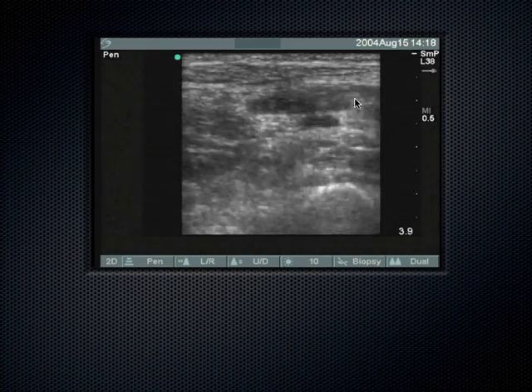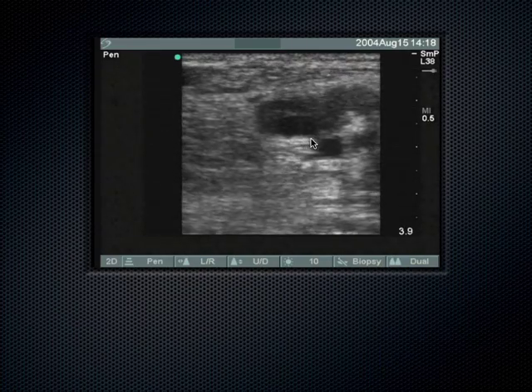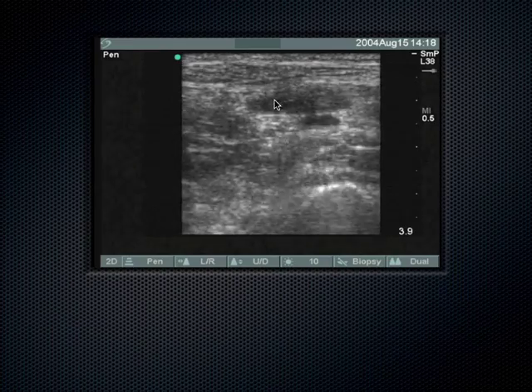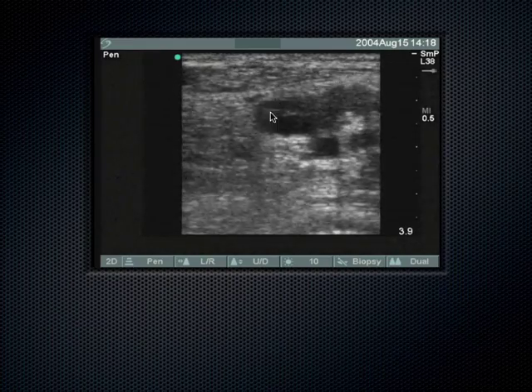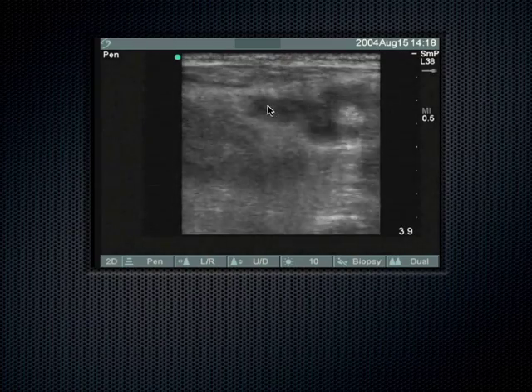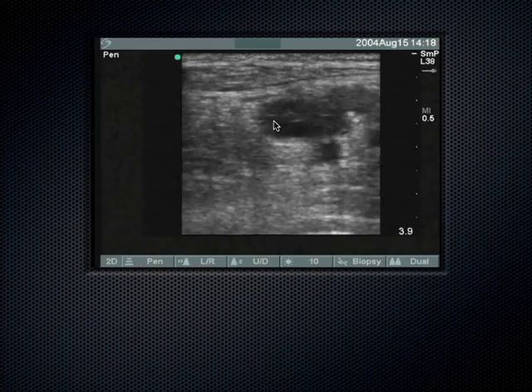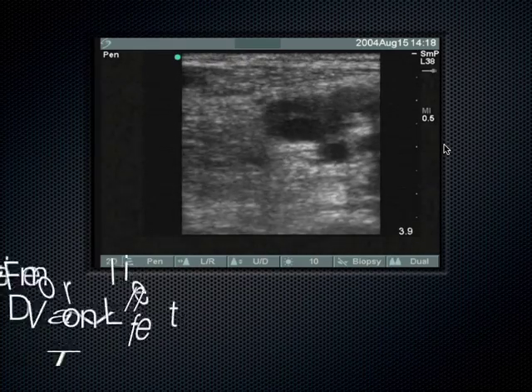Good, the left leg. So this is the artery over here. This is the vein trying to compress right here. But if you notice, the vein doesn't all the way compress. You see how this is one little segment right there where these walls are just not coming together, right? It's subtle, but once in a while, right there, we see it. This is a person who's got a non-occlusive DVT on the left leg there.